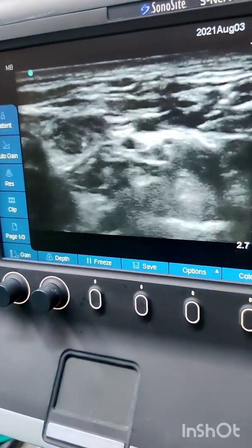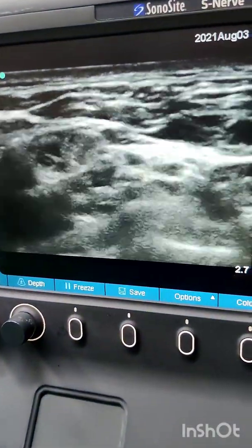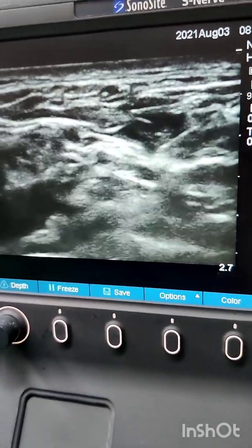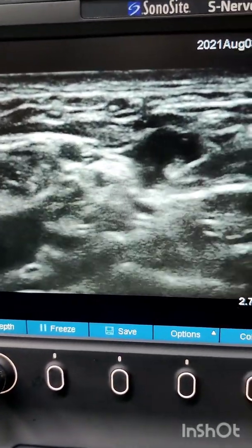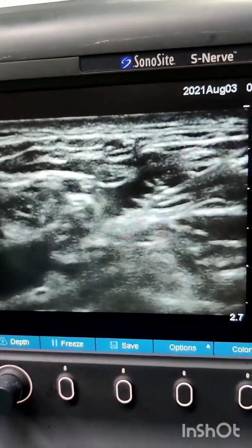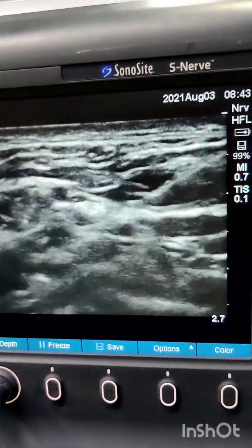The block needle is introduced about 1 cm away from the probe from lateral to medial side. Needle is introduced almost flat and completely in plane to the ultrasound probe for better visualization of its entire length. Always keep the needle's tip under vision in the ultrasound image.